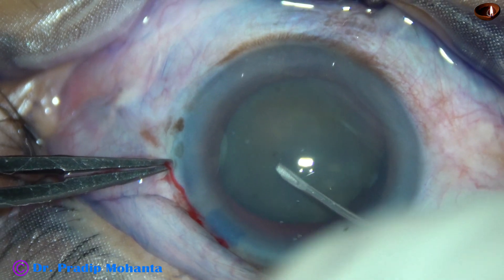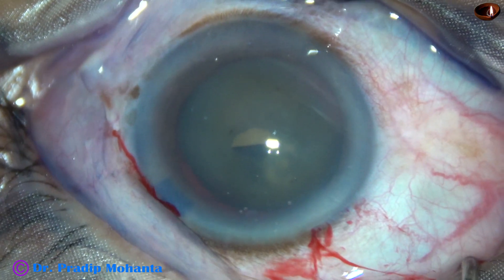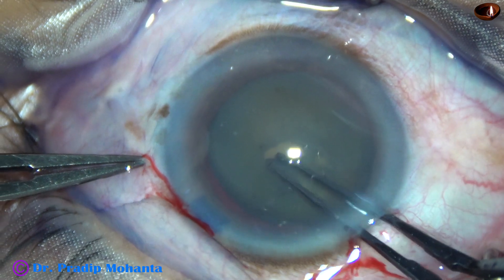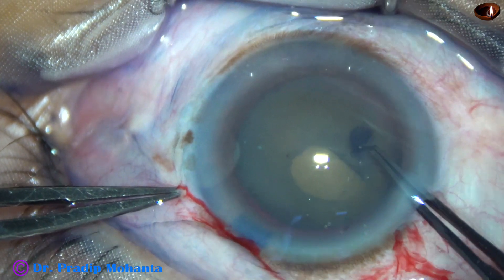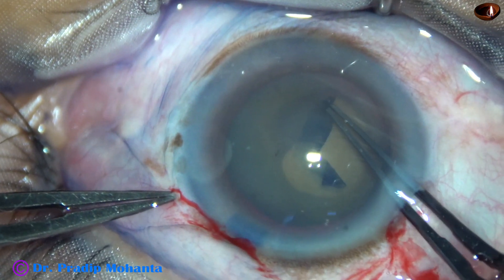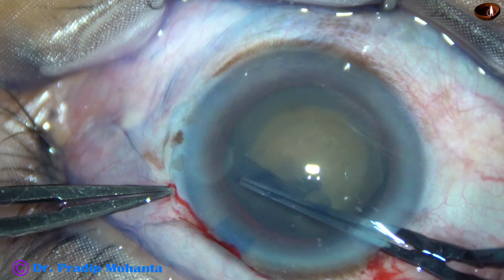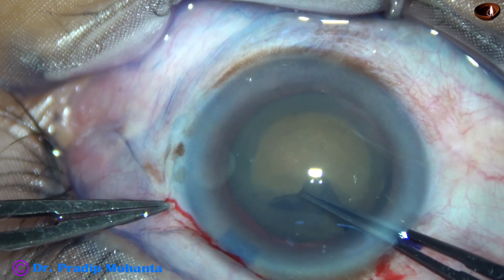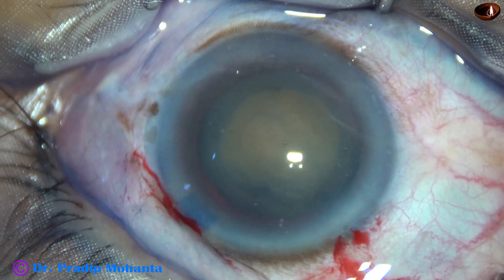As I try to make this first puncture, I can appreciate some amount of zonular weakness. So I am going to do the rhexis very gently — no jerky pull, very gently. I am going along anticlockwise, remaining away from the zonular attachment and remaining away from the anterior capsule. And it is done. The rhexis is about 5 mm.